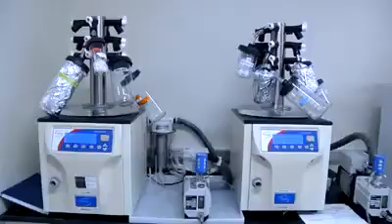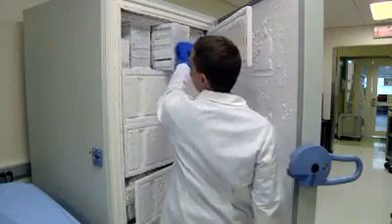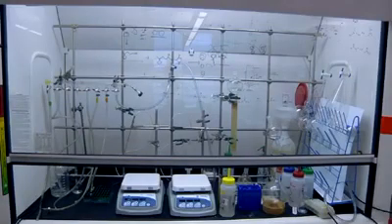This lens is currently undergoing further testing, and it has a while yet before it appears on the market. But their work shows that there is space on the contact lens for innovation, and the possibilities go well beyond the passive administration of drugs. One can envision really high-tech things where, for example, you would have a contact lens resting on the cornea that would be able to sense many parameters of the eye beneath it.